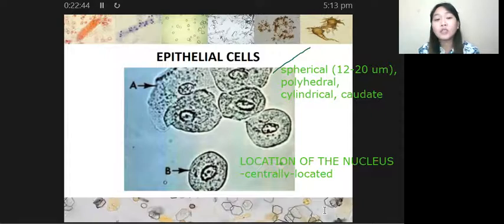In the laboratory, with regard to the collection of your urine sample, we should also know how the urine sample was collected. Because if, for example, there are many transitional epithelial cells, it does not automatically mean the patient has a pathologic condition.